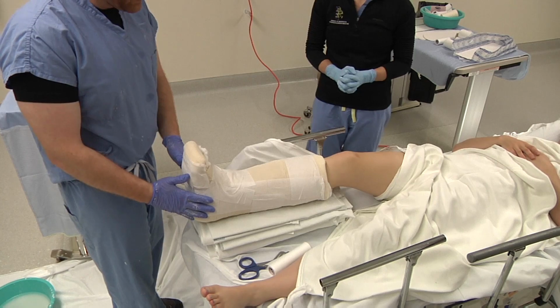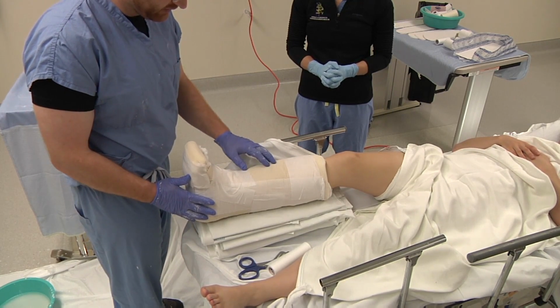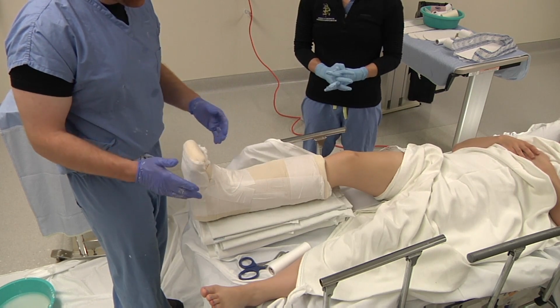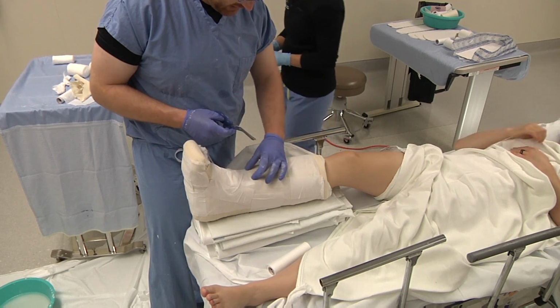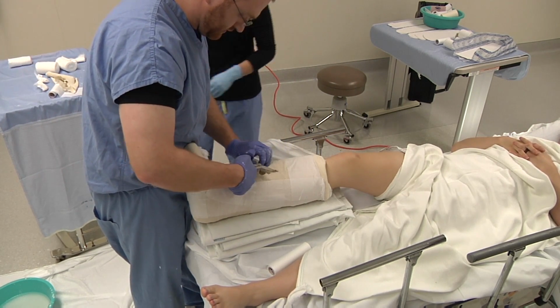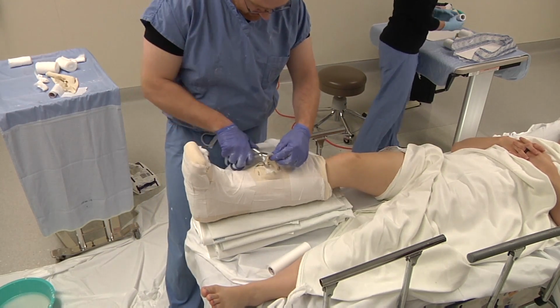Other modifications that can be done with the short leg or long leg splint include windowing. Windowing is helpful in the cases of having to do neurovascular exams, compartment checks. To do that simply, your plaster ends over the anterior tibia. You can, with caution not to cut the patient, cut out a window.